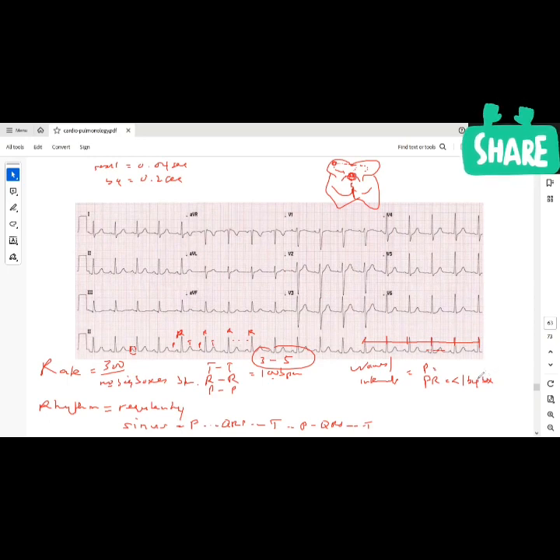If it's more than that, that is a prolonged PR interval, and that tells me that there's something wrong with the AV node, right? There's a delay. Or if the PR interval is too short or absent, so you look at the P and there's no space, no segment between the P and the QRS complex, it means that the action potential is bypassing the AV node, right? And that would lead to an absent PR interval. You can see that in something like Wolff-Parkinson-White syndrome. So you look for that.